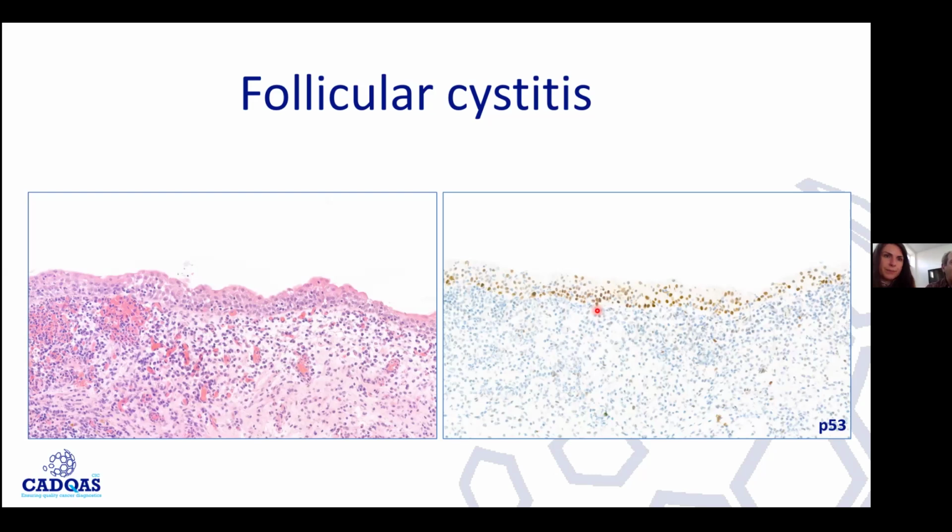For P53 in Barrett's esophagus, the thing I found most useful in Barrett's to assess dysplasia is presence of P53 mutant pattern, because it kind of rules out in my mind that I'm looking at a reactive inflammatory esophagus.